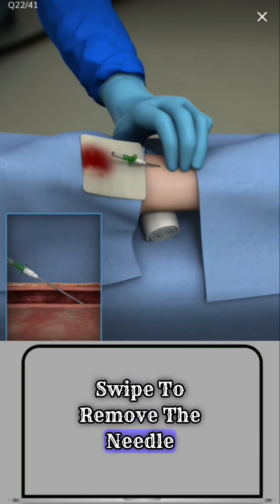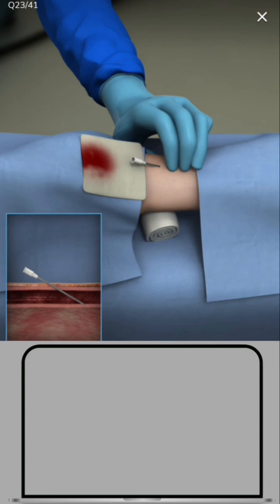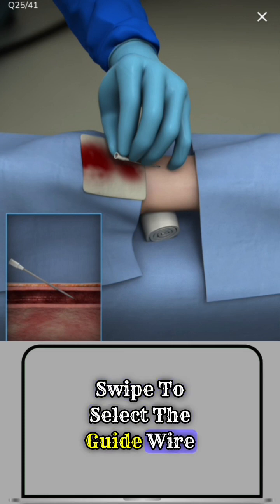Swipe to remove the needle. Stabilize the catheter using your non-dominant hand. Slowly withdraw the catheter until pulsatile blood flow is observed. Swipe to select the guide wire.